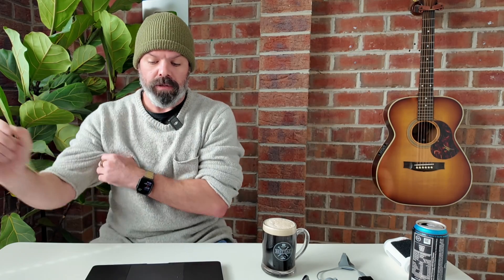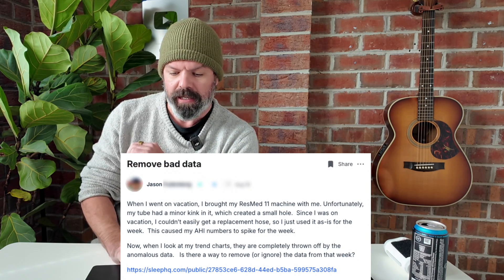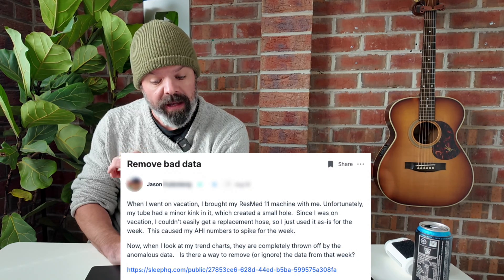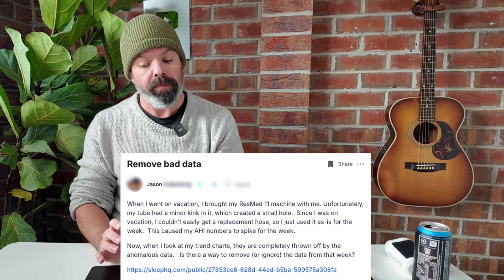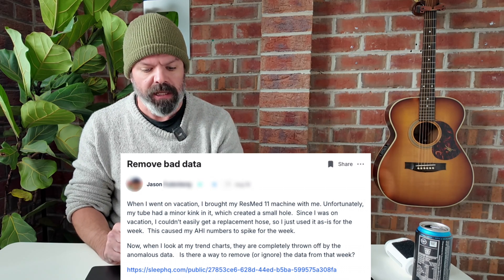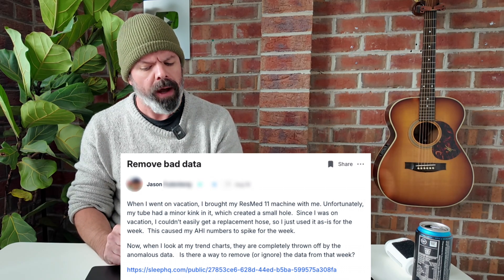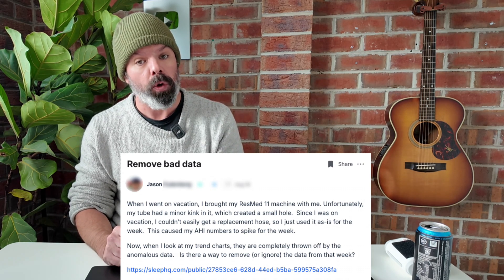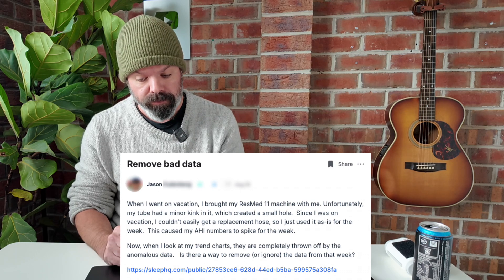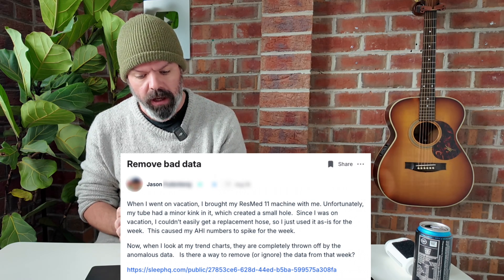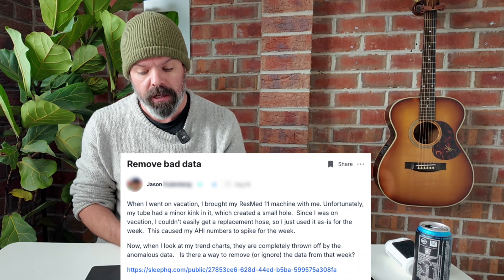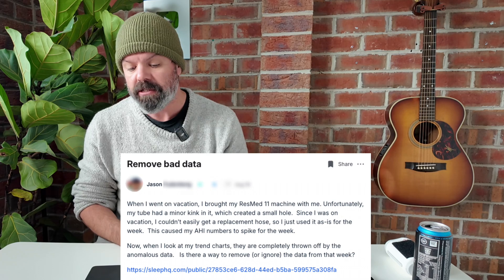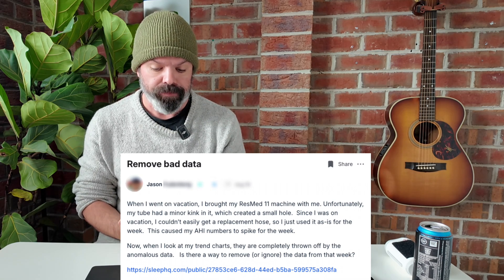Today I've got a great little SleepHQ case study for you. It's a bit of a mystery. Let's check out what Jason has to say. When I went on vacation, I brought my ResMed 11 machine with me. Unfortunately, my tube had a minor kink in it which created a small hole. Since I was on vacation, I couldn't easily get a replacement hose, so I just used it as is for the week.